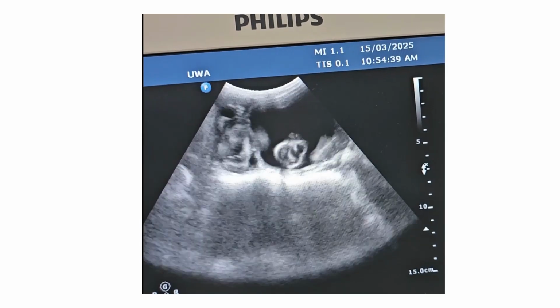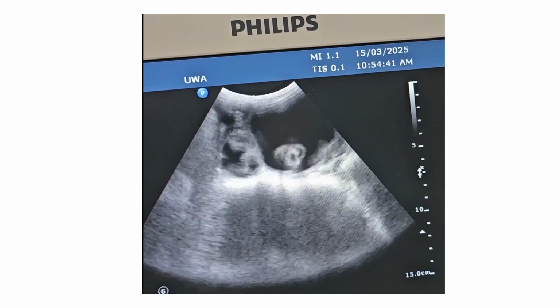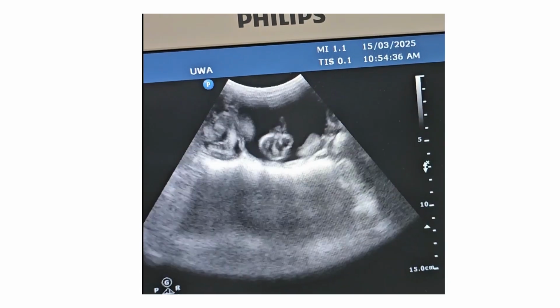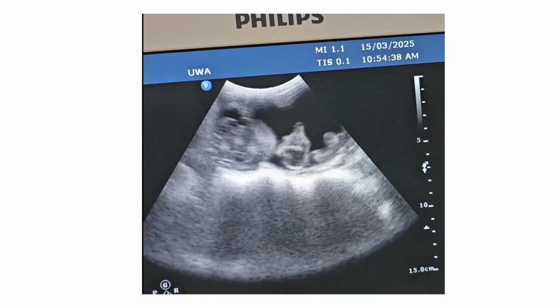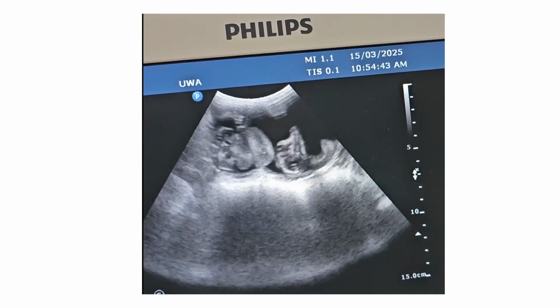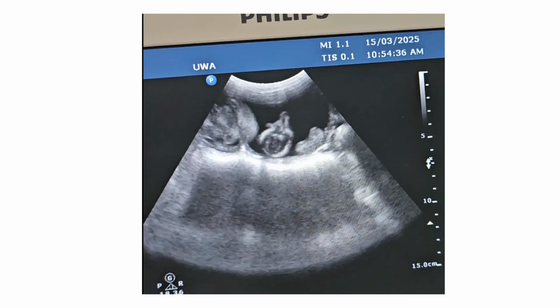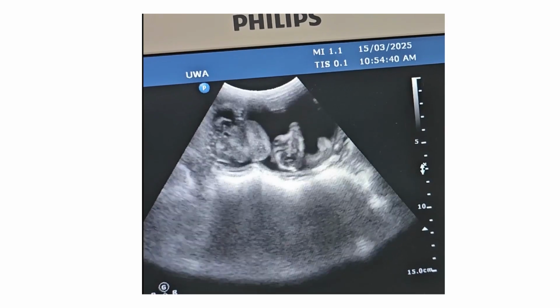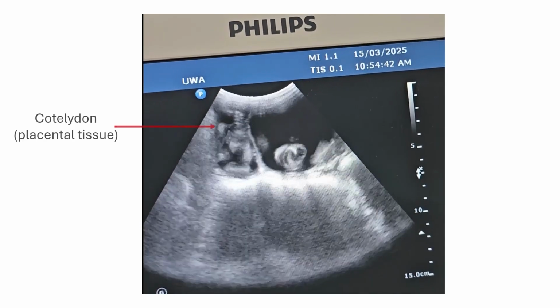This is another example of scanning through a pregnancy. In this case, the scanner is looking to see if there's more than one pregnancy or more than one fetus. To the right-hand side of the image, you can see the fetal skull, identifiable because of the high level of reflection and high white density of that bone outlining the skull.